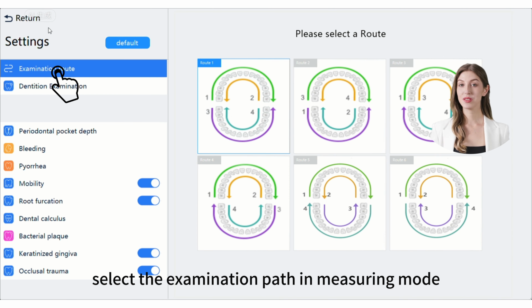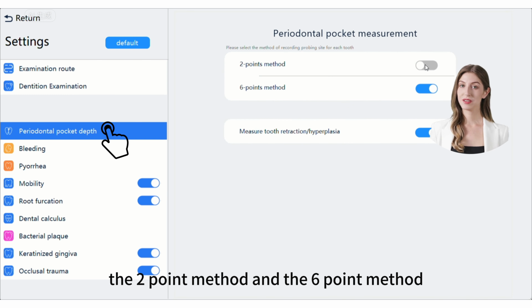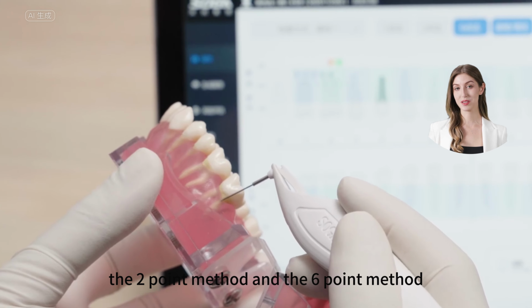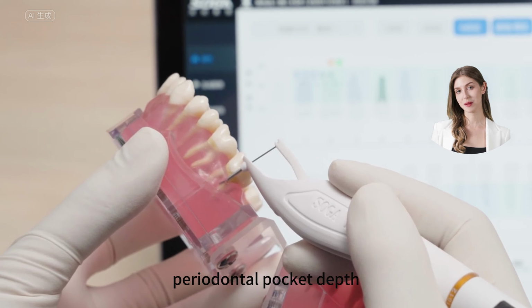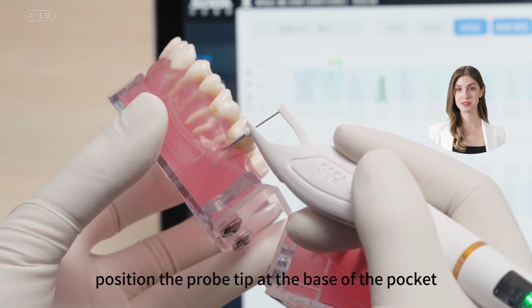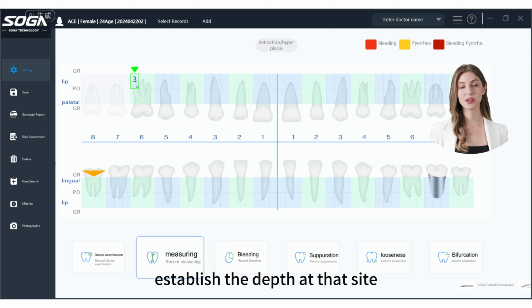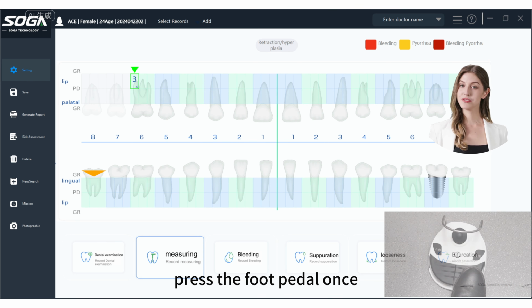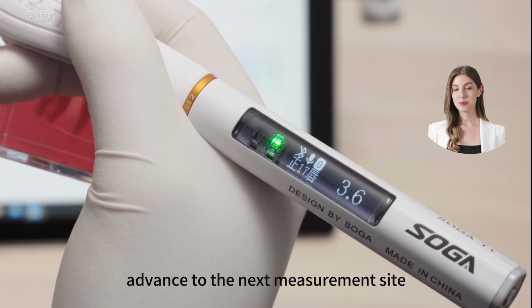To begin, select the examination path in measurement. Two techniques are offered: the 2-point method and the 6-point method. Here is a demonstration on measuring periodontal pocket depth. Position the probe tip at the base of the pocket. Align the sleeve's margin with the gum line to establish the depth at that site. Press the foot pedal once. The software will log the depth and advance to the next measurement site.